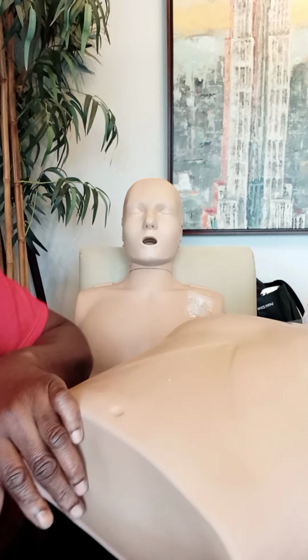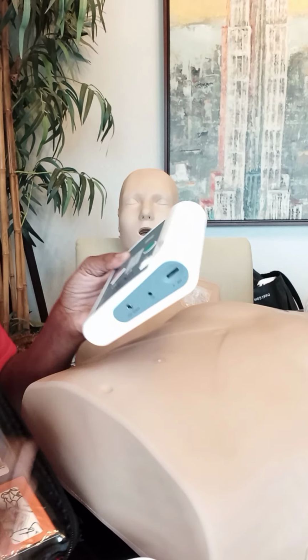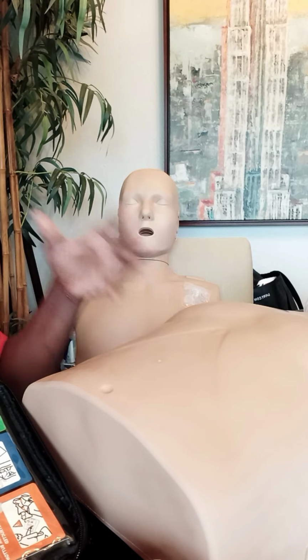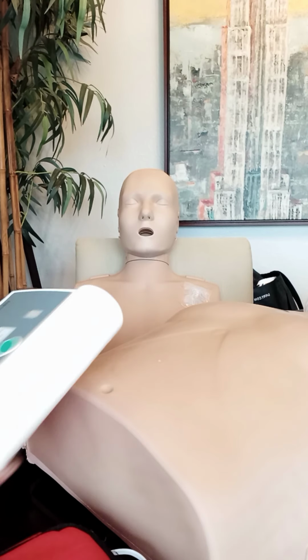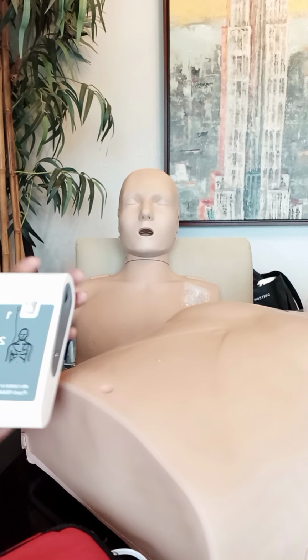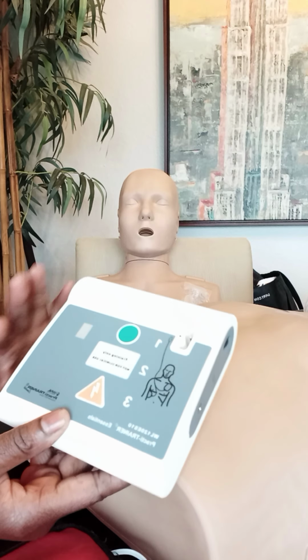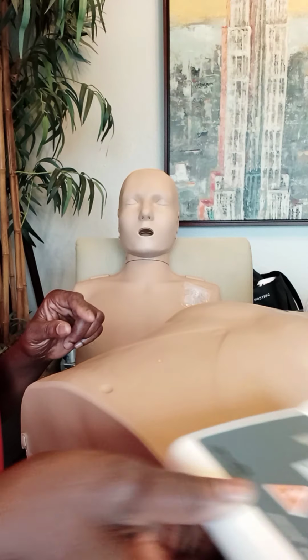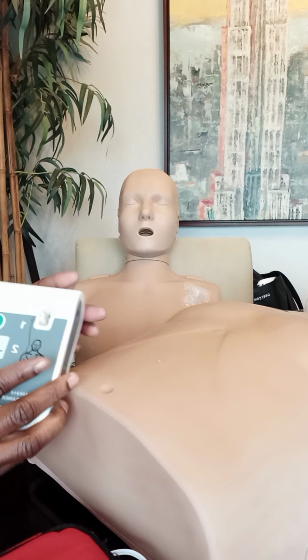So you know what an AED is for. This is what shocks the heart to get it to restart so it can begin to contract and relax, pushing blood. Get it out of the abnormal rhythm, which is ventricular fibrillation. So the act of using the defibrillator is defibrillation, because you want to get rid of that abnormal rhythm, ventricular fibrillation.